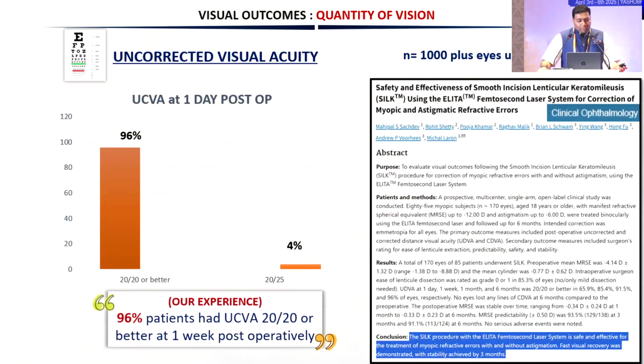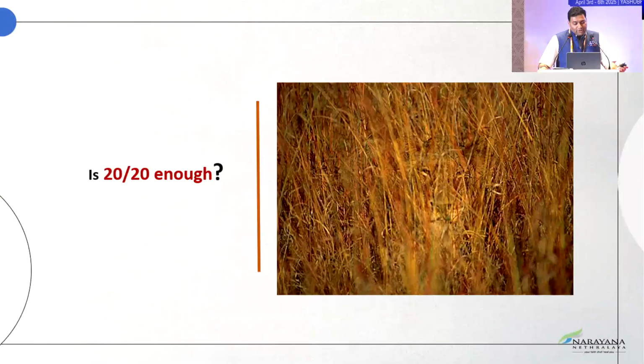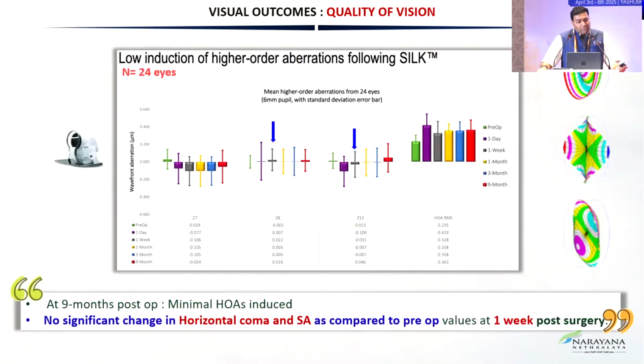It is giving you that optimal vision, what your Contura or one of your laser lenticule, the excimer lasers would give. But today is not just about 20/20, it's about trying to give them the best quality of vision. So when you are dealing with very advanced level of changing the shape, and when your cornea is healing well, when you have an anterior and posterior part of your lenticule being the same, your collapse of your collagen fibrils, I believe, should be less. Again, this is more of a theoretical model which we are working on, and that will reduce your aberrations, and that's what this paper was published on.